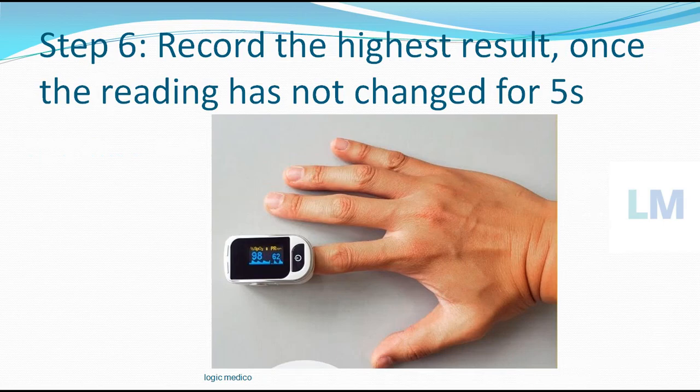Record the highest result obtained in that time — whatever is the highest value you got, that is your recording. Once the reading has not changed for 5 seconds, if the same reading is persistent — in this case, 98 — that is your SpO2, the saturation of oxygen. The saturation of oxygen is 98 and the pulse rate is 62. For 5 seconds, if it is showing the same values, then this is your pulse oxygen recording: this is your pulse rate and this is your oxygen level.